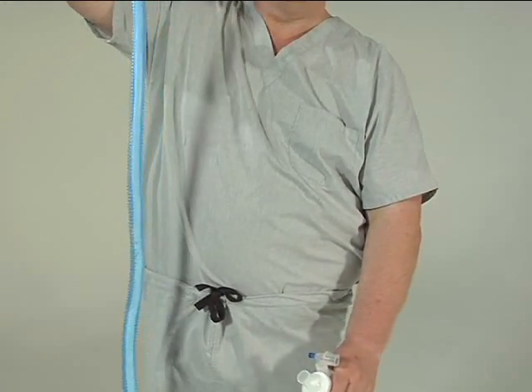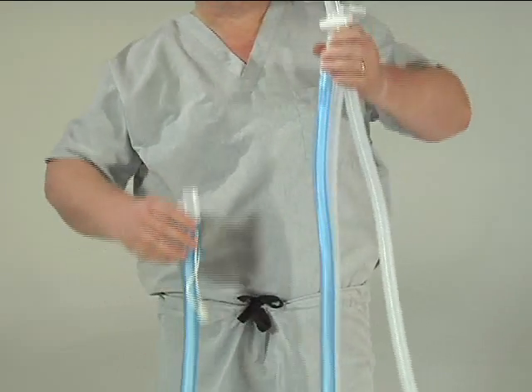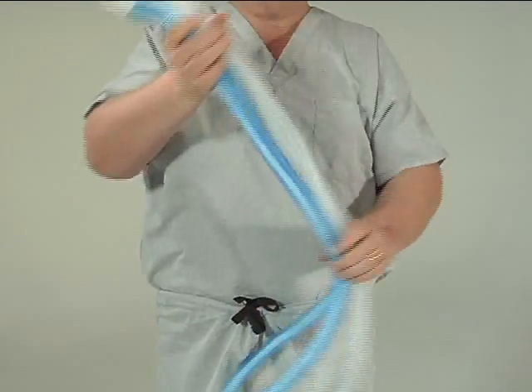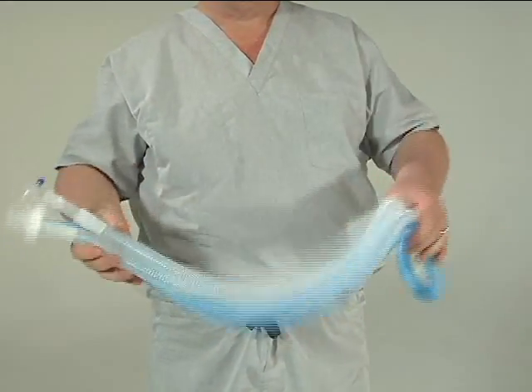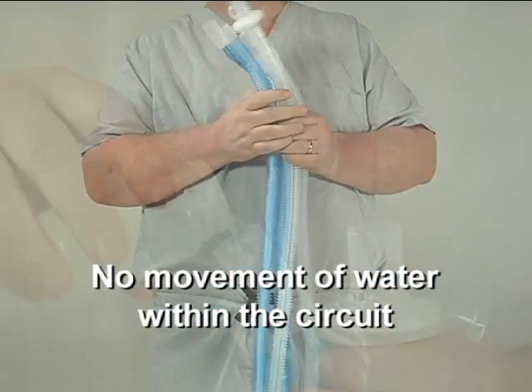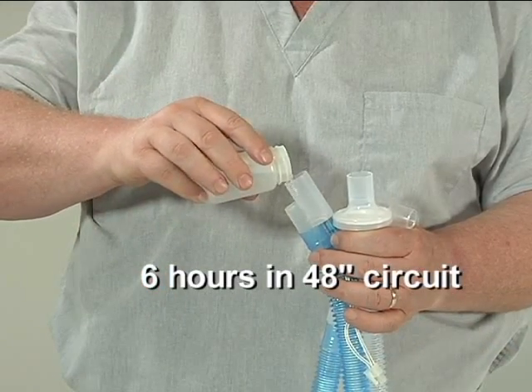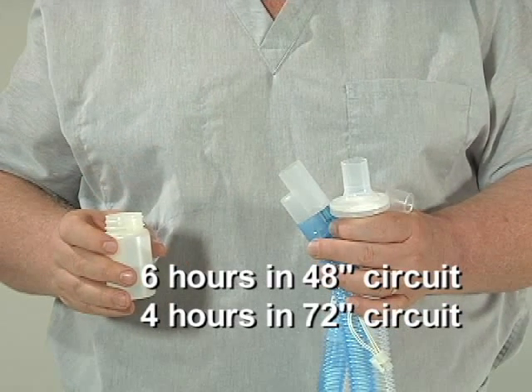Lower the patient end of the tube to saturate the wick of the patient end first. Then lower the machine end of the tube to complete the absorption of the water into the wick material. Gently shake the circuit to distribute the water evenly onto the entire length of the wick. There should be no movement of water within the circuit. The water introduced into the circuit should be sufficient to provide up to six hours of operation in a 48-inch circuit and up to four hours in a 72-inch circuit.